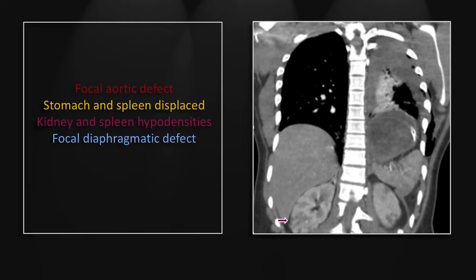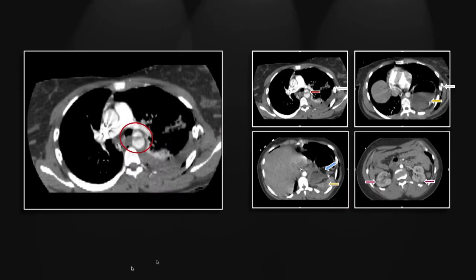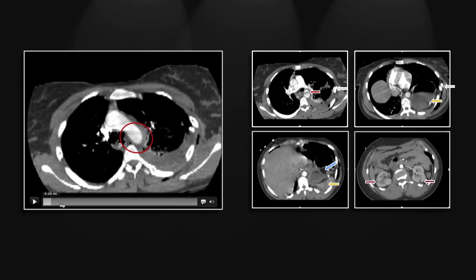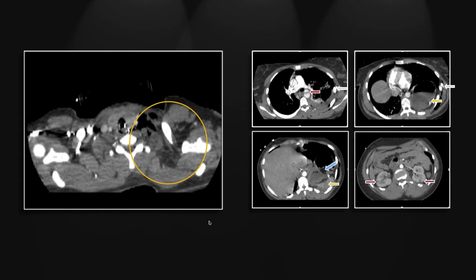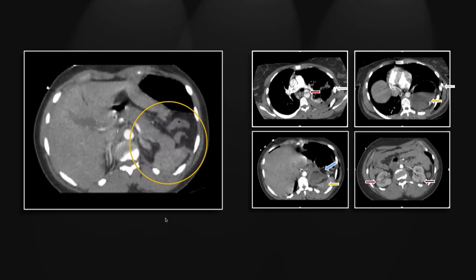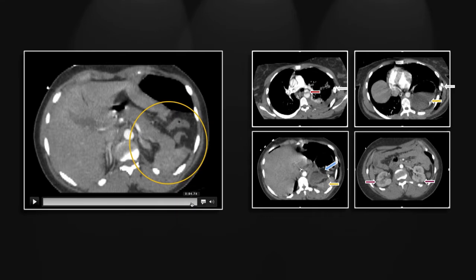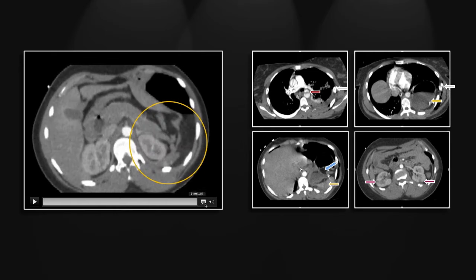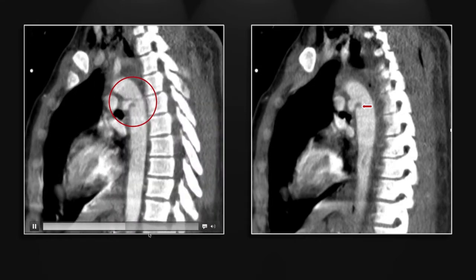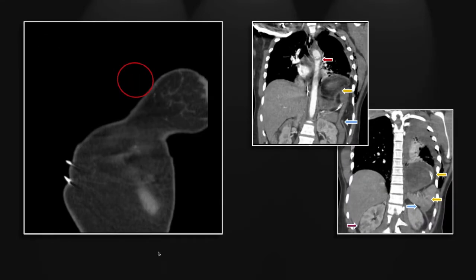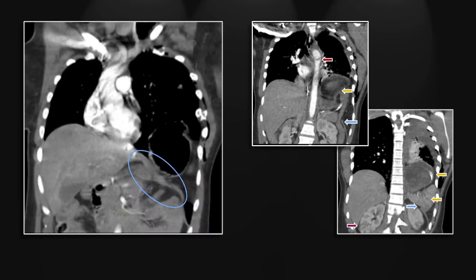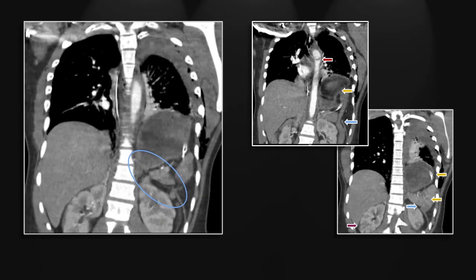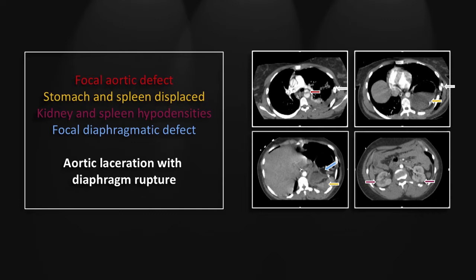Another view of the cortical hypodensities in the kidneys and again the free edge of the torn diaphragm. There is the aortic laceration, and here the herniated stomach, colon, spleen and the diaphragmatic defect at the very end of that image set. Again the sagittals nicely show the intimal flap and pseudoaneurysm. The coronals show the intimal flap, the herniated stomach, colon and spleen, and the torn free edge of the left hemidiaphragm. So that is a case of aortic laceration with diaphragm rupture.